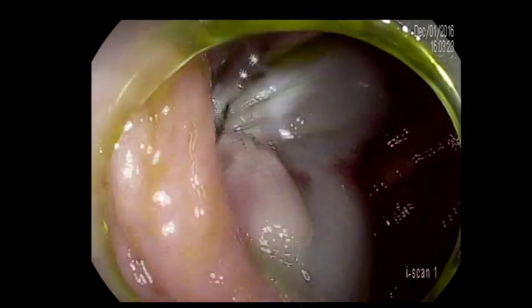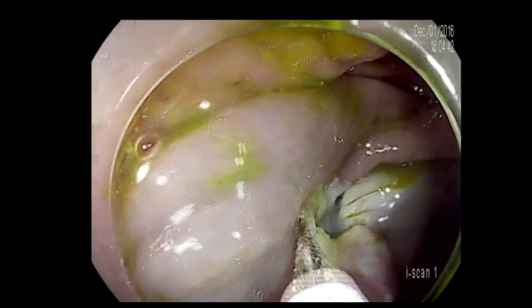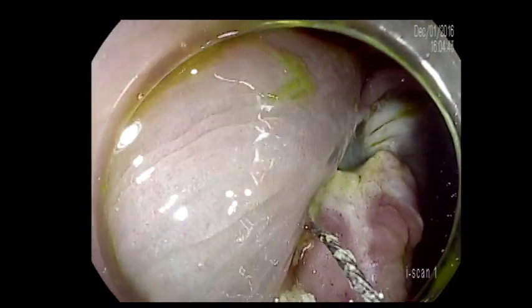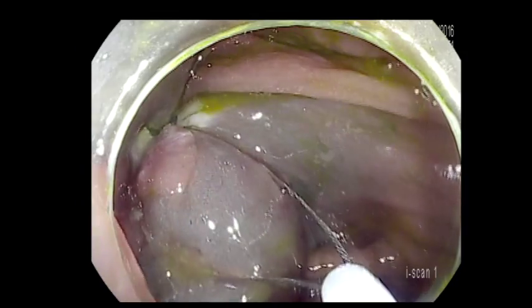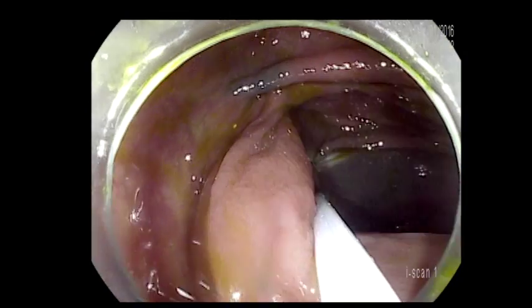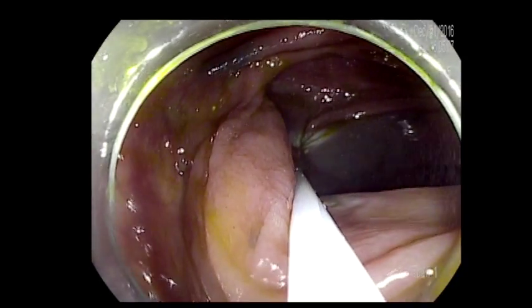If a situation like that happens — and it can happen to any one of us — you just have to keep going. Do a piecemeal polypectomy, try to remove the second piece, and try to get as much as you can. I tried that second piece longitudinally but it didn't work, so we went horizontally. The scope was a little bit far away, so we applied some pressure.